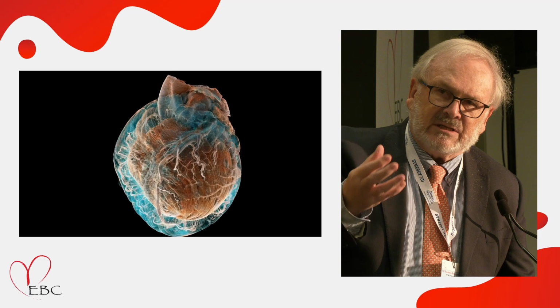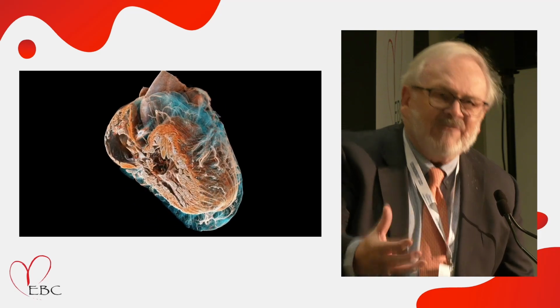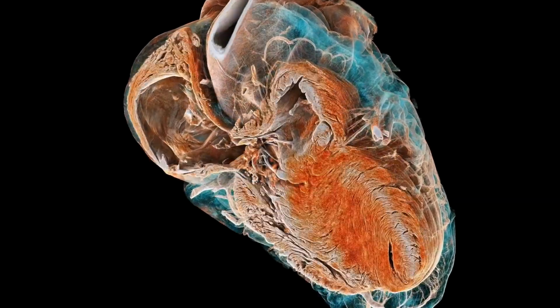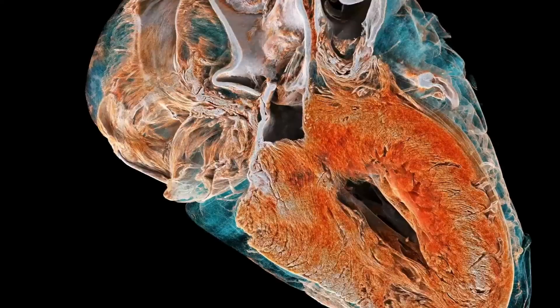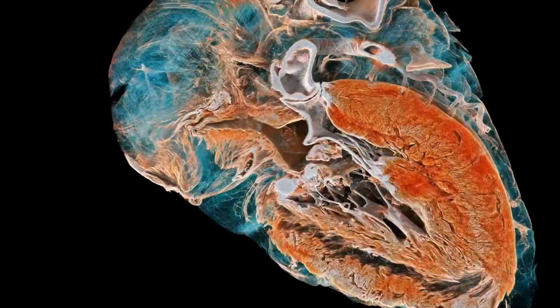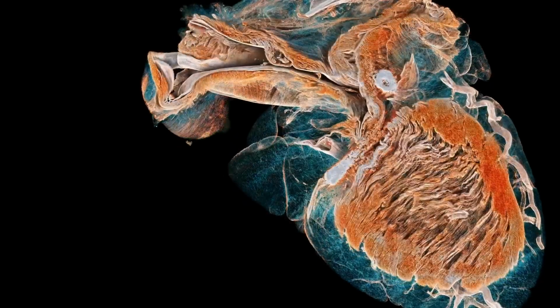So it's as if the fat has lifted away the coronary artery from the myocardium. I have never seen that picture, and it gives us a lot of ideas. The black is the place where you have some subendocardial ischemia or injury.